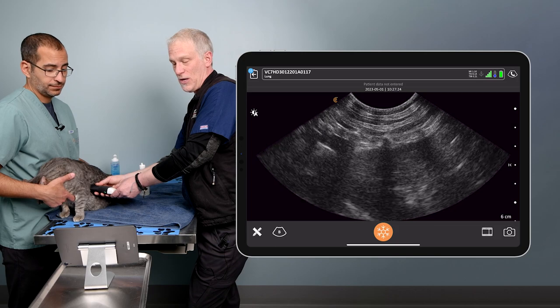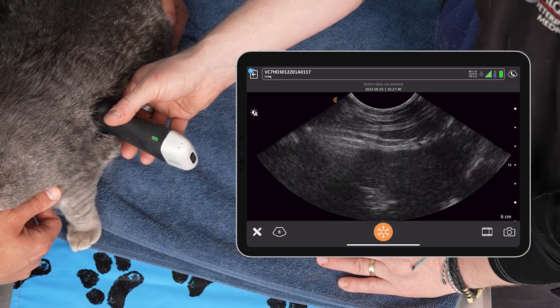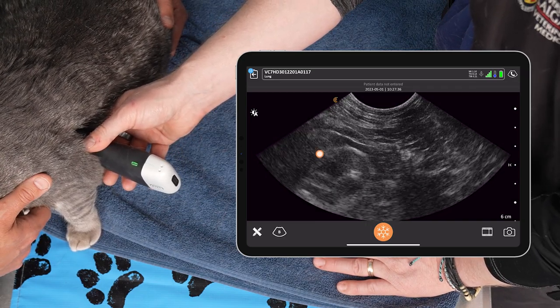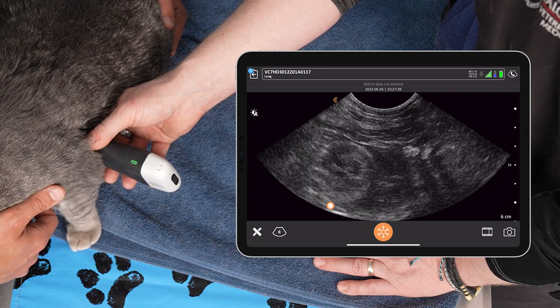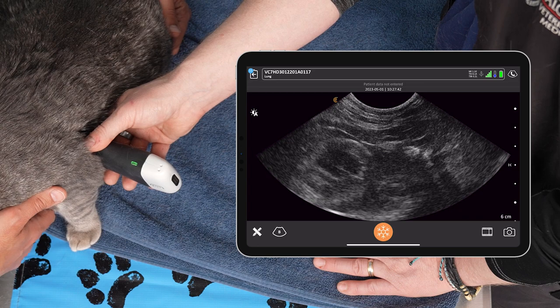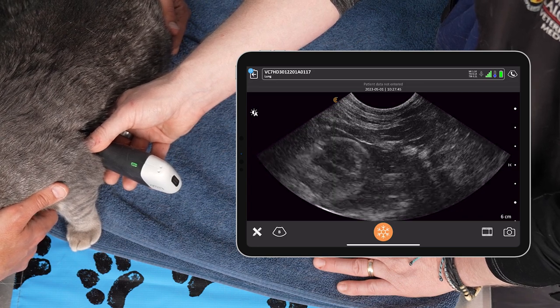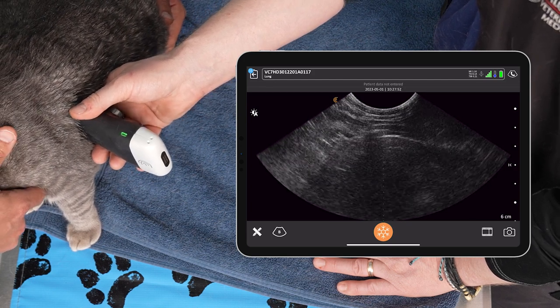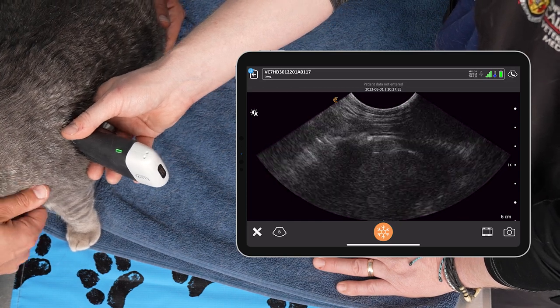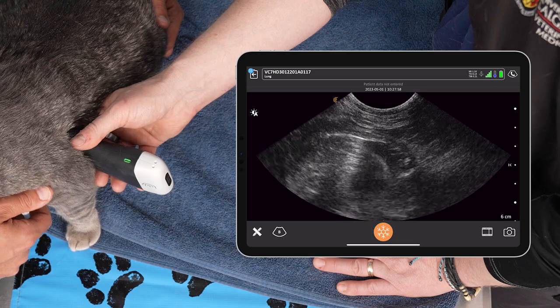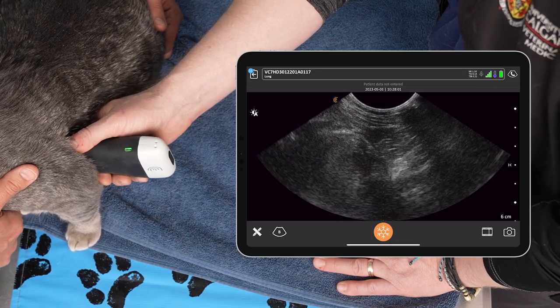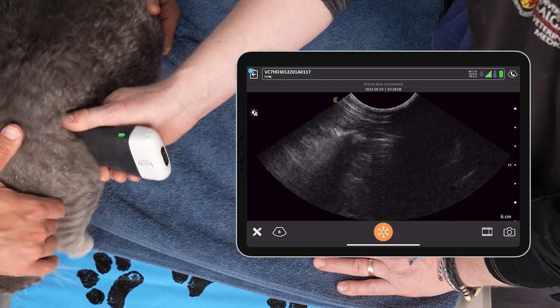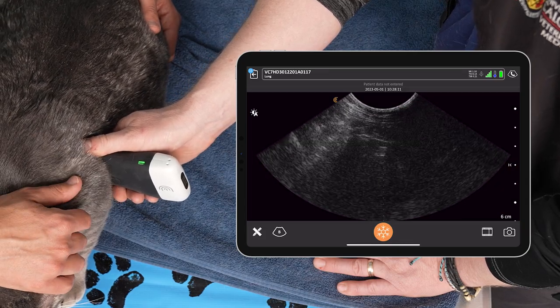They might give us an answer to why our patient isn't doing well. So we rotate our probe parallel — if you're over a liver, jump one rib cranial and that should put us at the heart, with the probe parallel and marker directed dorsally. Now you're at the ventral pleural border, and we want to slide the probe up between the ribs to catch the ventral lung border so you don't miss any pathology in that cardiac notch. Scanning along the pleural line with the probe parallel, jumping a rib cranial and back — no B-lines, no consolidation, no pleural effusion — and then scanning up onto the lungs in a higher region looking for pathology.